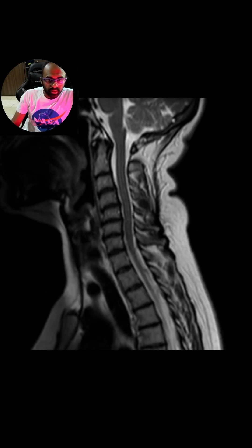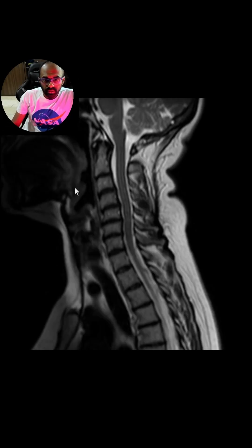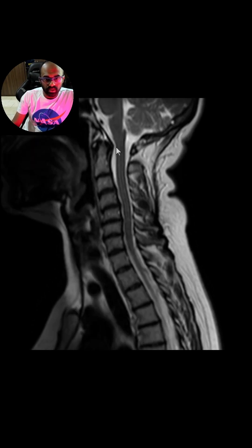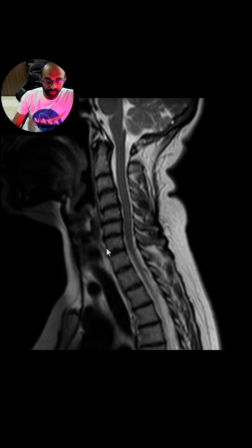Let's read this cervical spine sagittal T2-weighted image. The cervical medullary junction appears normal. As you can see, there is a reversal of the lordosis and there are endplate degenerative changes.